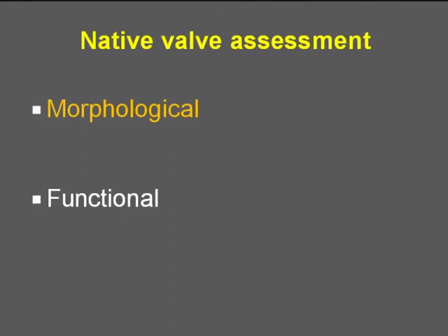So having done the various planes for cardiac assessment, I'll now talk about the various abnormalities that you can encounter. And I've divided them broadly into two categories. So you have morphological assessment and functional assessment. And we'll start with the valve morphology first.